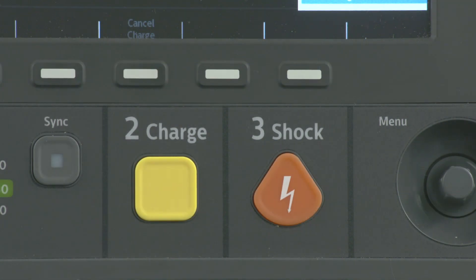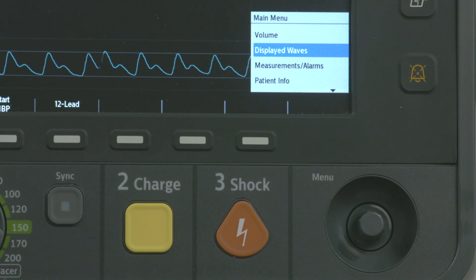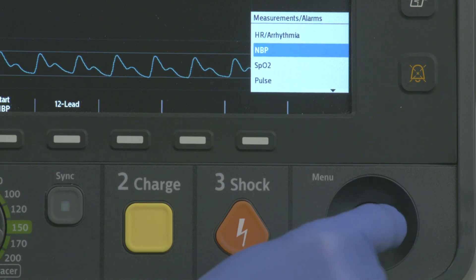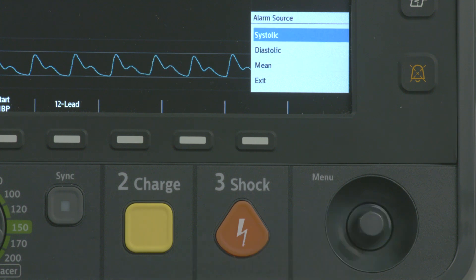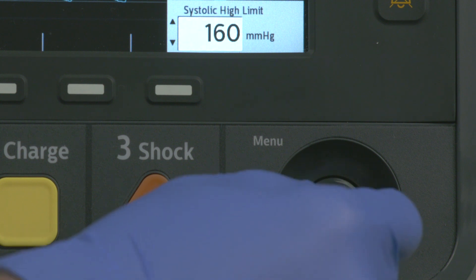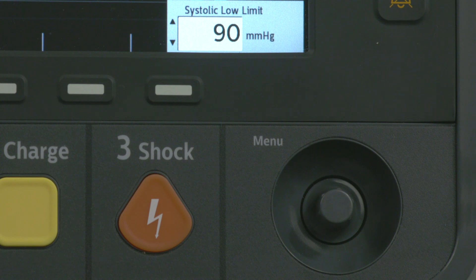These controls are used for automated or manual defibrillation, synchronized cardioversion, and pacing. This is the Smart Select knob. Press it and the main menu displays. Turn the knob clockwise or counter-clockwise to scroll down or up a menu's list, then press it again to select that item. If you have a numeric selection window open, turning the knob clockwise increases the numerical value while counter-clockwise decreases the value; press it again to select that value.